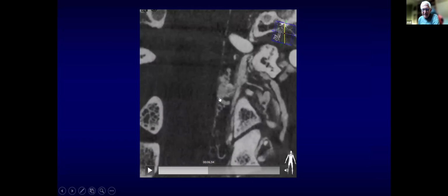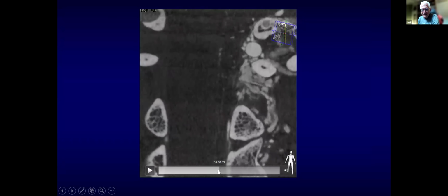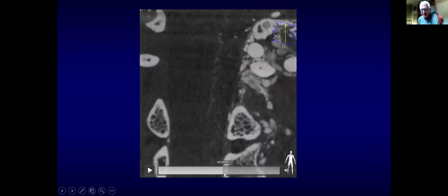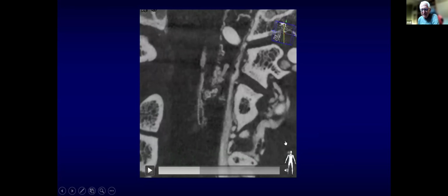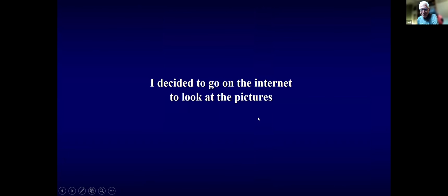So this is on the surface of the spinal cord, and all this is epidural. It doesn't really look like a venous pouch anyway. It looks like many small vessels, what I might call a nidus. These are still images, so you can see the tangle coming from the anterior spinal artery. See the anterior spinal artery coming down, and this kind of nidus there.